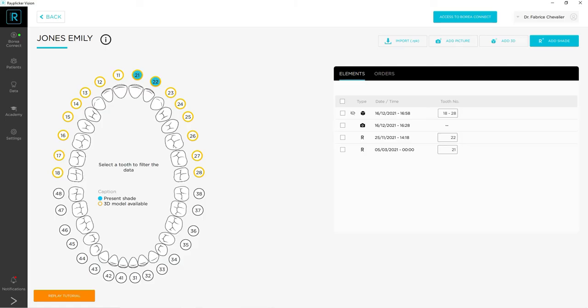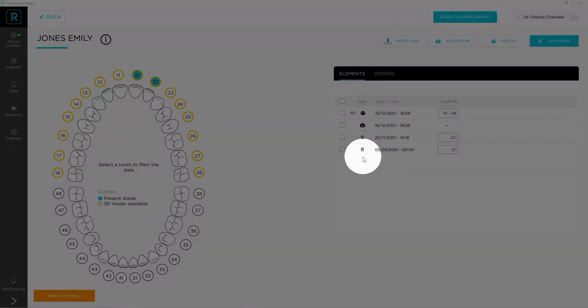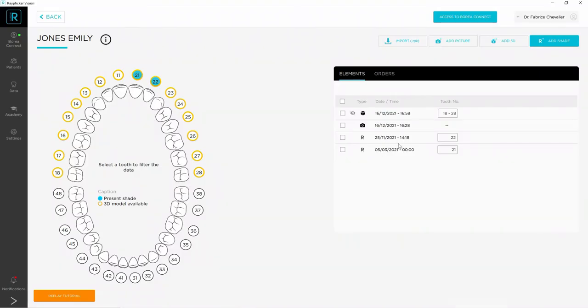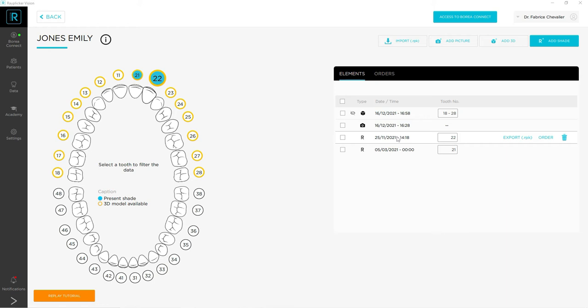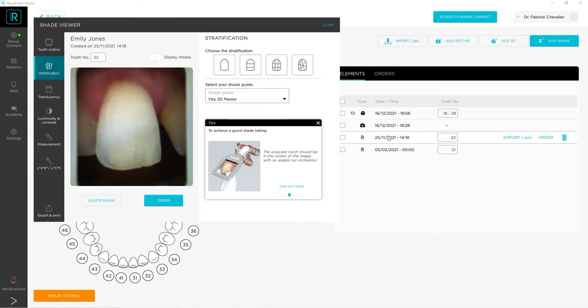Hi everyone and welcome to your replica tutorials. Today we are going to see how to use the Shade Viewer. Let's go! To open the Shade Viewer on your replica vision software, double-click on the arrow file of your choice in the list of your patient's items. Once you have done that, you will see a new window appear on the left side of your screen.